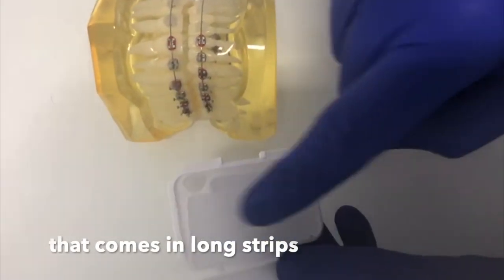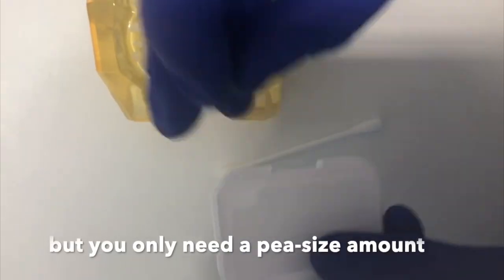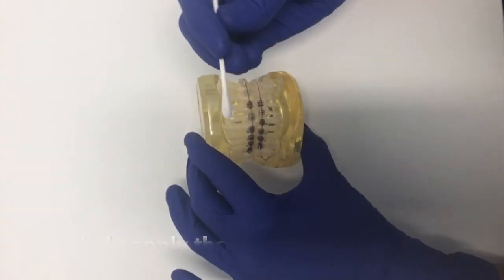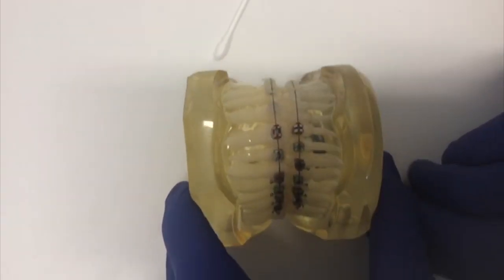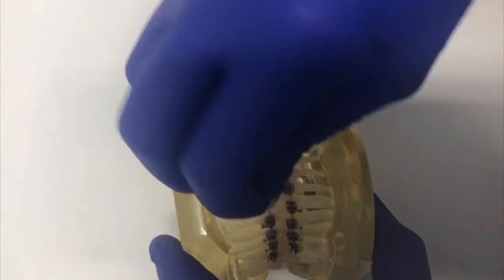The wax comes in long strips but you only need a small pea-sized amount for each square. To help with applying the wax, first of all you can dry around the area if you have a cotton bud to hand. Dry around the square and then apply the wax straight onto the bracket itself.